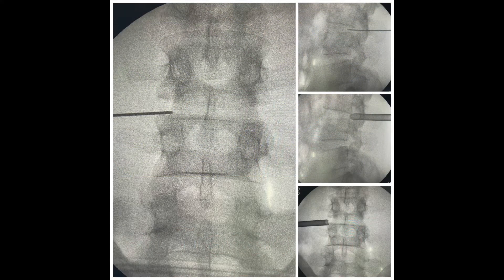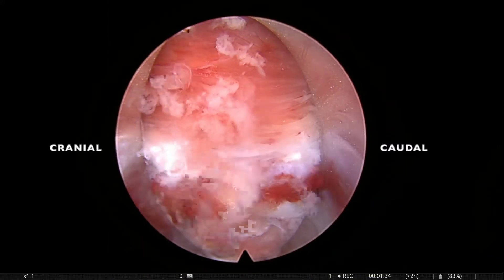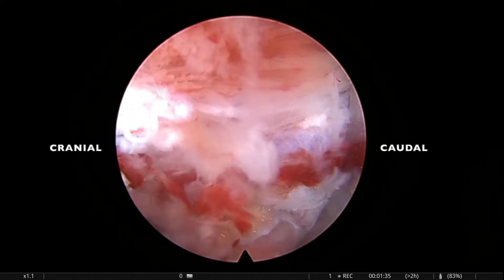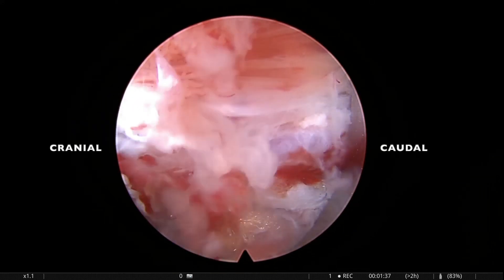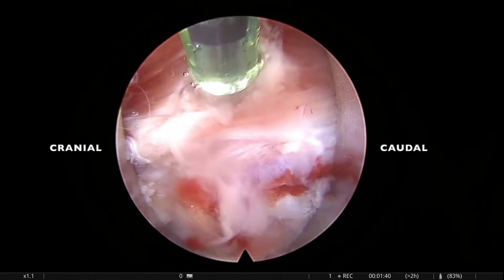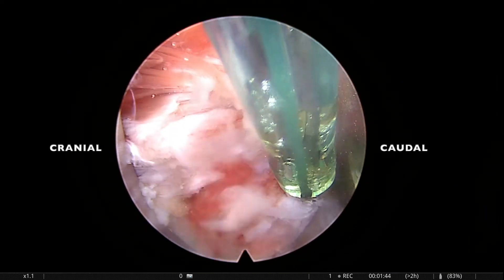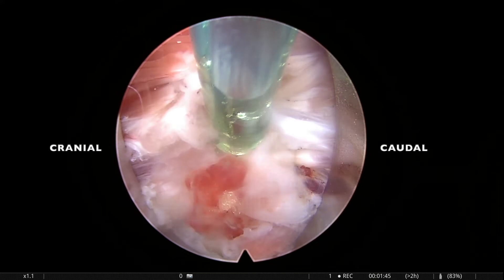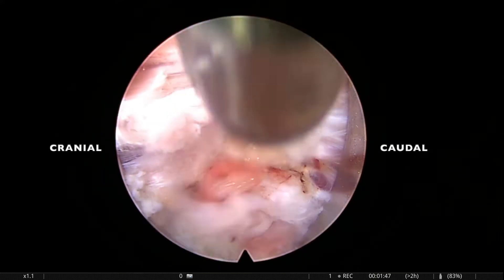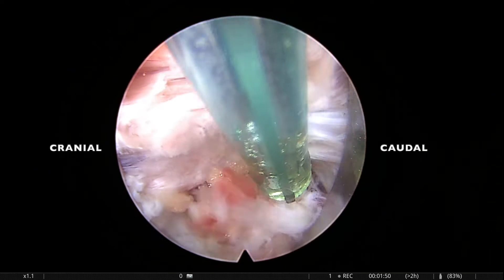The needle is showing a deeper entry, working in the foramen. Once the scope is placed you can see the cranial-caudal orientation. The muscle fibers are coagulated a bit. The 6 o'clock position is the disc area where we need to work, and the 9 o'clock is the exiting root.